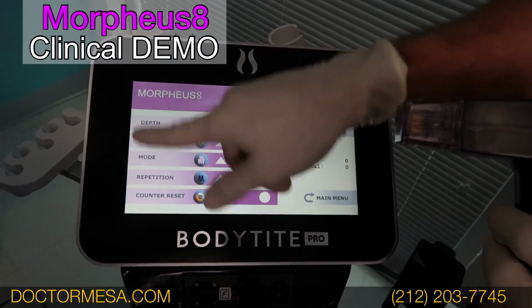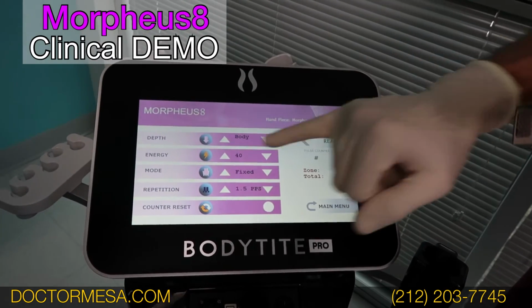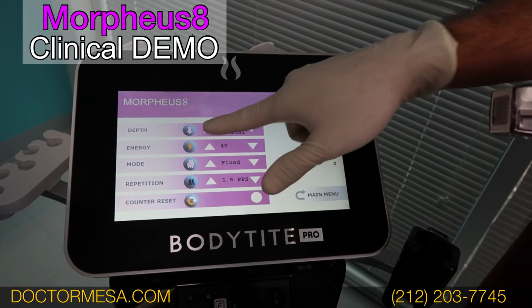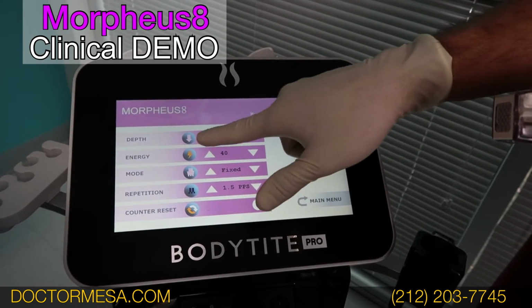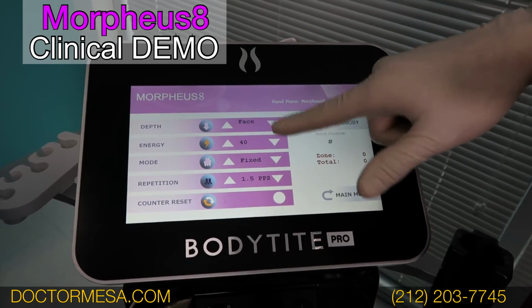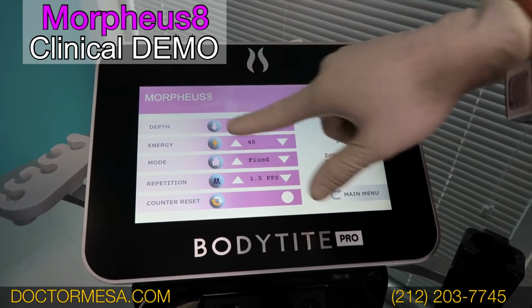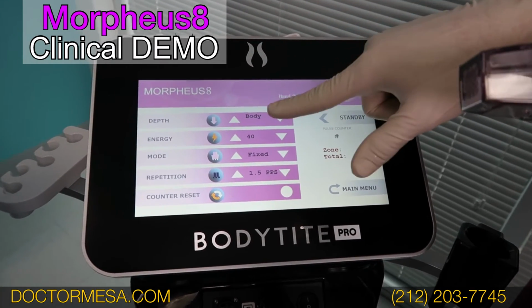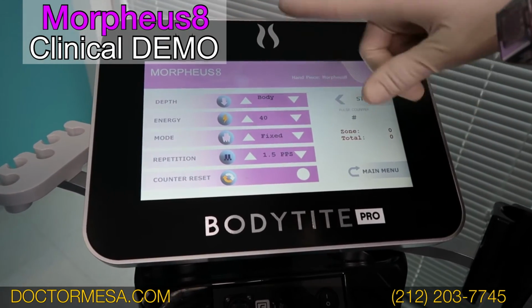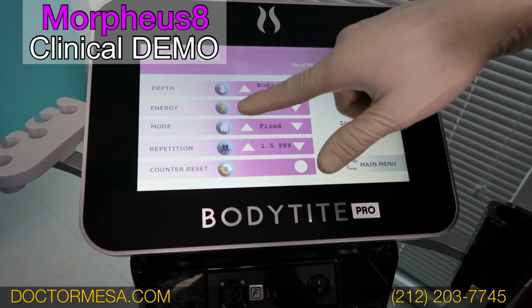Okay, this is the Morpheus8 interface. This is the handheld device, and we have different settings. We have the depth. This has 3 settings. We have the periorbital, we have the face, and we have the body. The first two, the periorbital and the face, are the skin tightening, or the Fractora built-in ability. When we switch it to the body setting, the pins go deeper into the fat and produce the fat melting capabilities. So we have the energy. We're going to set it at 45.